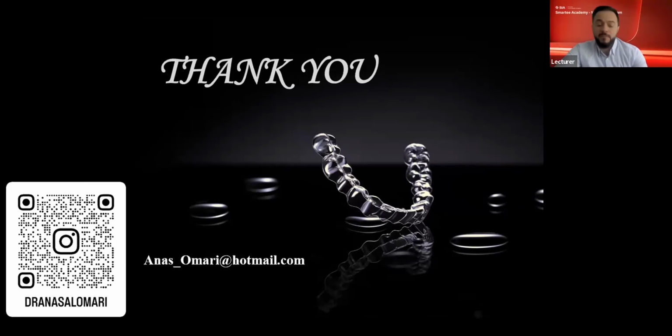And sorry, I forgot to show you that in some of the cases where we did distalization, we took the X-ray after that, and actually the roots were parallel. So there wasn't a lot of tipping. But when we have a significant amount of distalization, that needs to be even more controlled. And by having these tools, you can minimize the side effects of distalization.